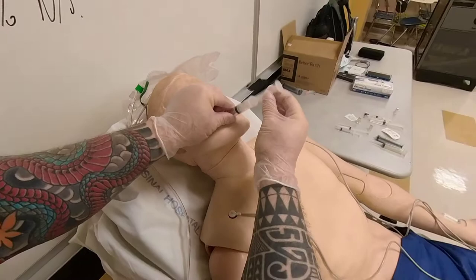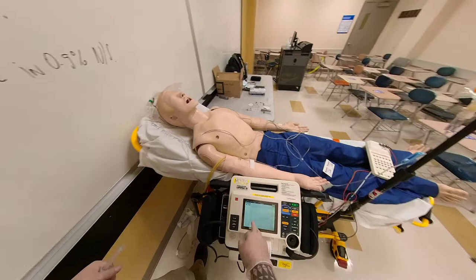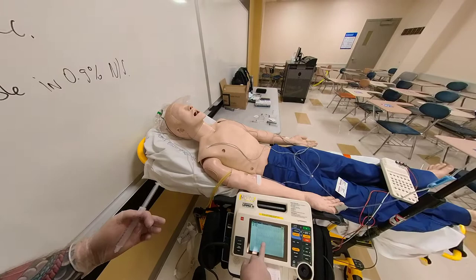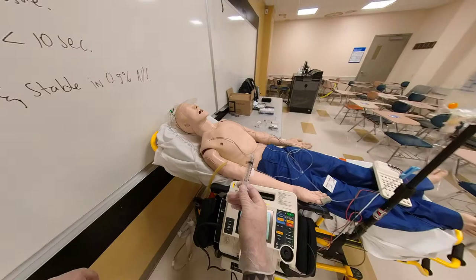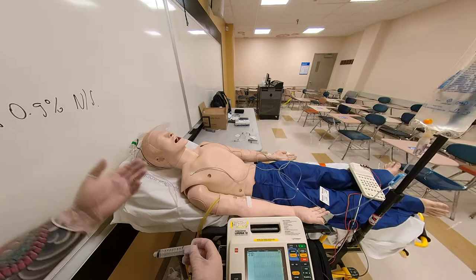Then you're going to lower the patient flat and raise the patient's legs, observing the monitor for cardioversion. If this doesn't occur, the patient has not responded to the non-invasive vagal maneuver stimulation with the syringe. You could look at the REVERT trial — this was very successfully done, where they converted patients utilizing this method. So now we determined this procedure did not work.